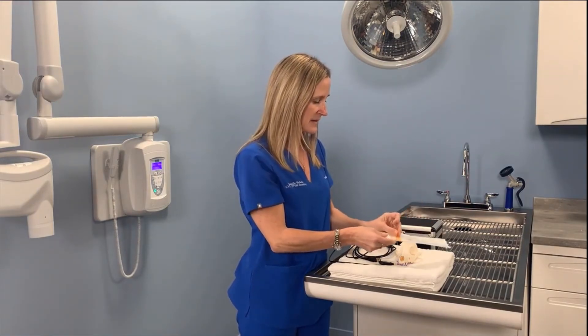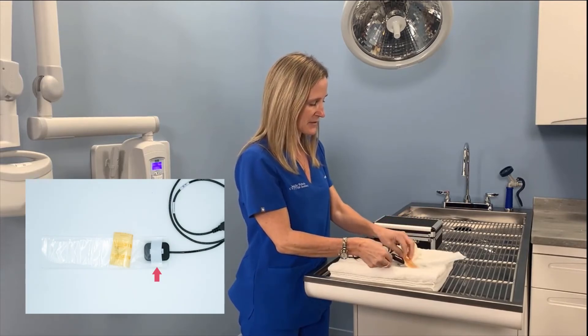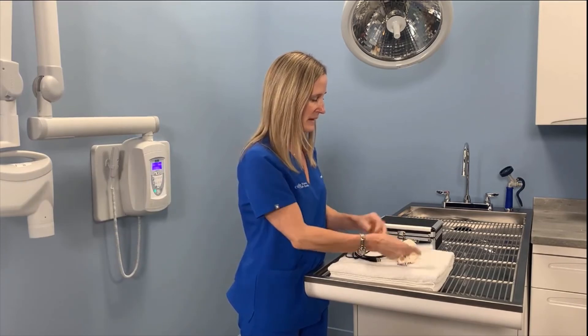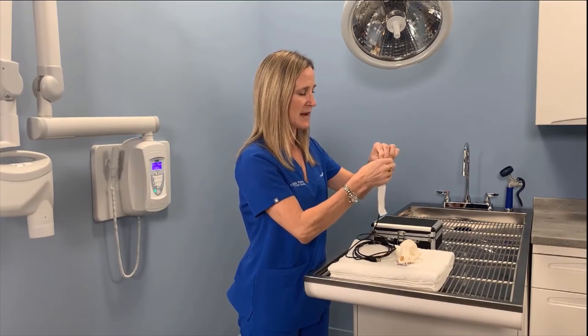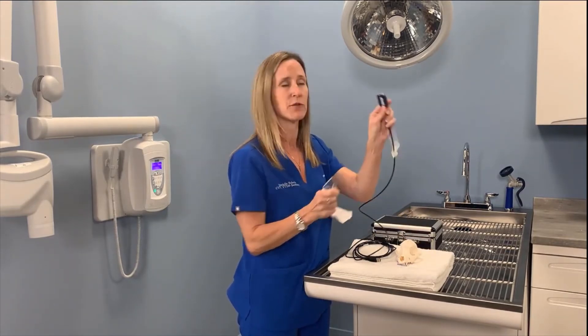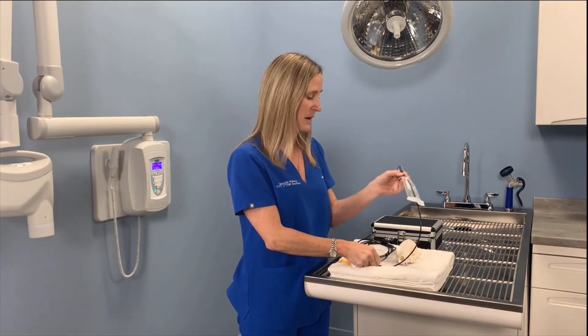It's very easy to use. You're going to lift up this white tab and slide your sensor in. Push it all the way in, then ease it up the rest of the way. There's a front and a back piece of plastic that you can remove. Now your sensor has the sheath on it and it's ready to go in a patient's mouth.